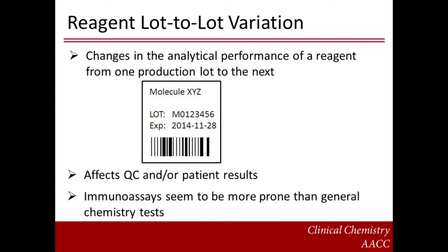References 3 through 6 at the end of this presentation provide examples of lot-to-lot variability that have been observed for insulin-like growth factor 1, prostate-specific antigen, anti-hepatitis antibody, and human chorionic gonadotropin immunoassays.